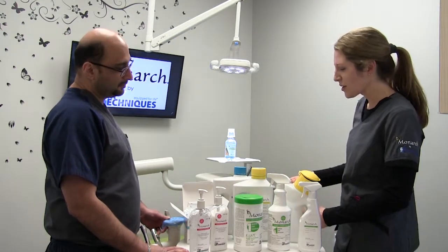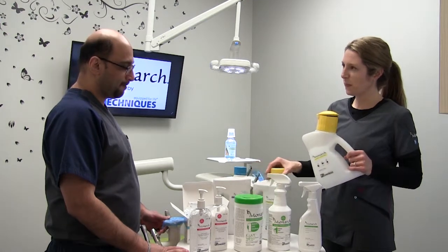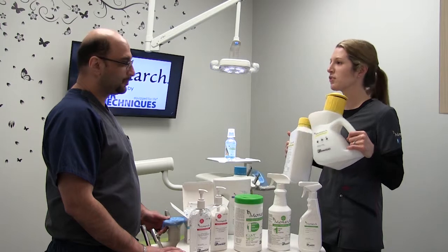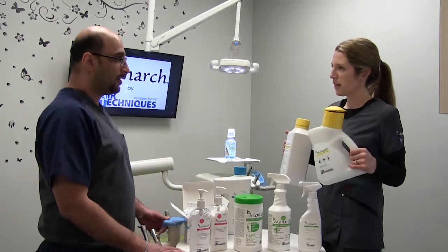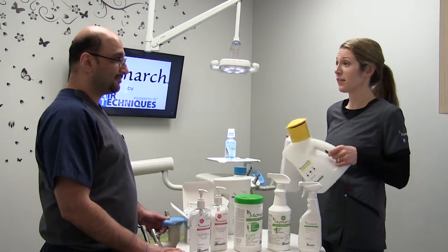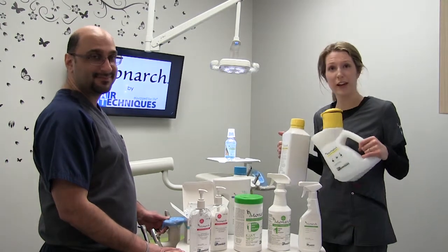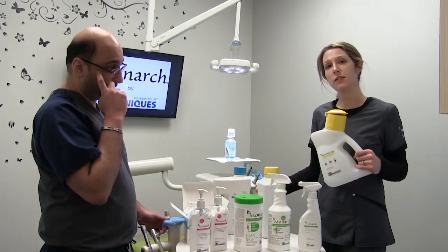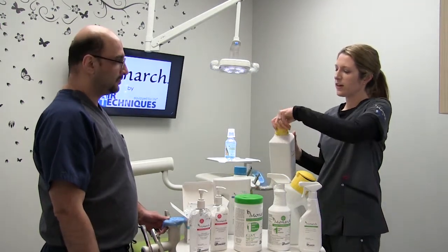I'll start with our equipment line cleaners. We have our CleanStream — it's a very easy to use system. It comes with a dispenser which allows your assistants and hygienists to flush the vacuum lines hands-free. The biggest thing is there's always a last patient of the day who is five minutes late, which leaves you behind, and often we forget to flush our vacuum lines. This provides an easy, effective way to do that, and it has a very nice clean fresh lemon scent.